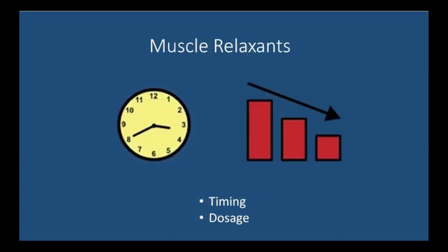Muscle relaxants. Medications that relax muscles can sometimes affect the muscles that control eye movement, leading to reduced targeting accuracy. Consult with a physician about possible adjustments to the timing or dosage of such medications to improve eye tracking performance.